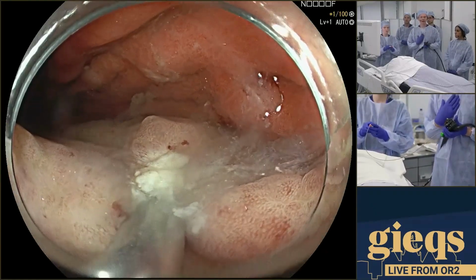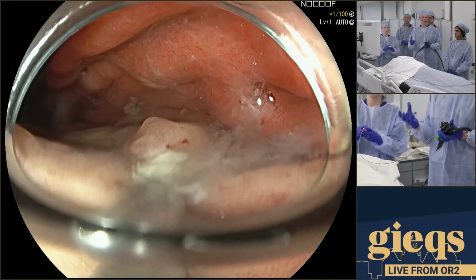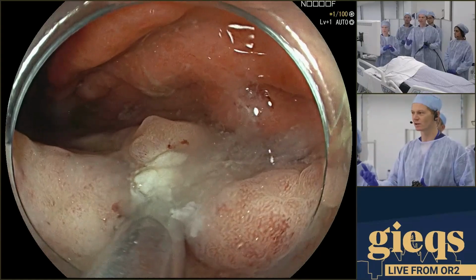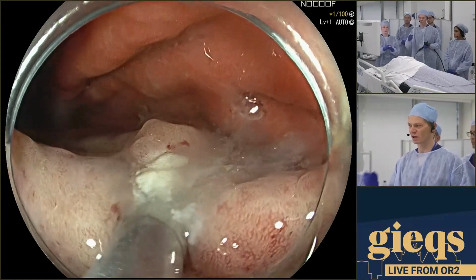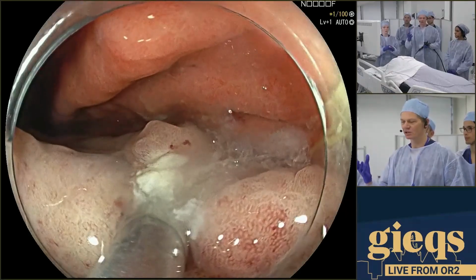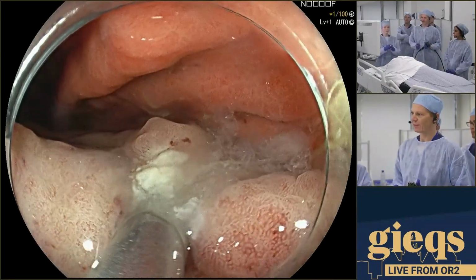I'm not so afraid of having a hyperplastic reaction around as Pradip is, because I know that it may happen, and I know that it wouldn't bother this patient. And obviously, I'm much more concerned if the patient is young, if the lesion is located in the antrum, and so on. And then we have to go with Emily really nicely.